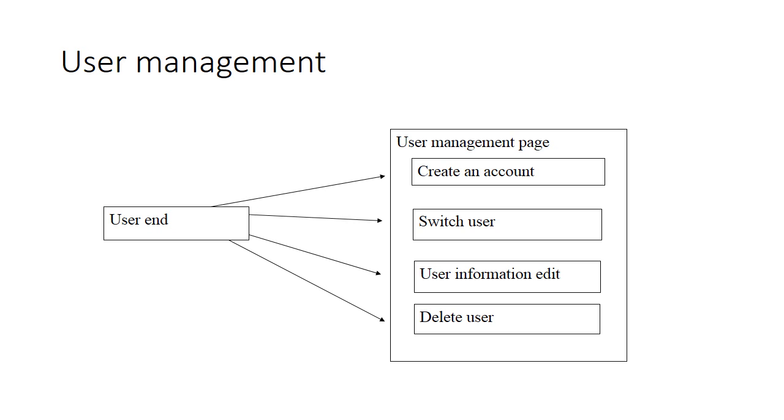The software needs a current user. Without user information at its initial use, it should offer the new user a way to create an account. Needed information includes name, sex, age, and emergency contact. The emergency contact is used when people get into an emergency situation like a heart attack. They can use this software to automatically call the emergency contact for help.